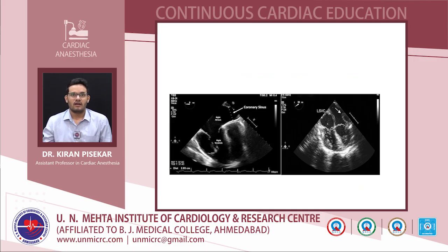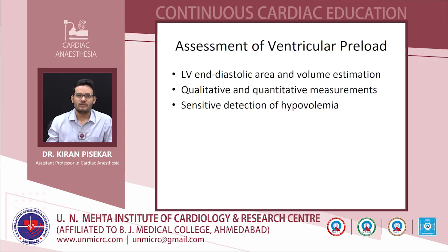About the anatomical variance, this is a TEE image showing the dilated coronary sinus. This is a midesophageal coronary sinus view, and this is a midesophageal four chamber view showing the left SVC. This structure is the left SVC, which can be seen in the midesophageal four chamber or five chamber view.